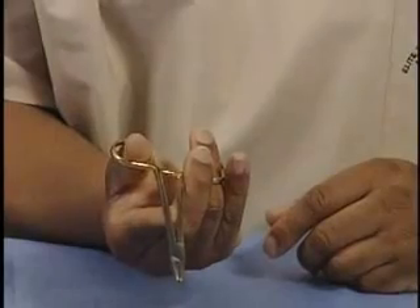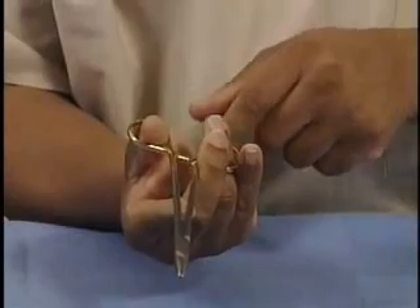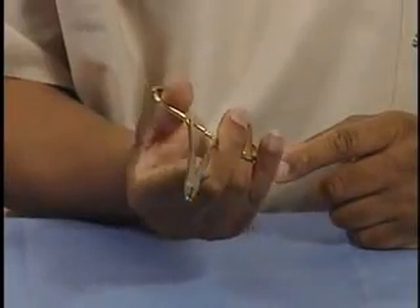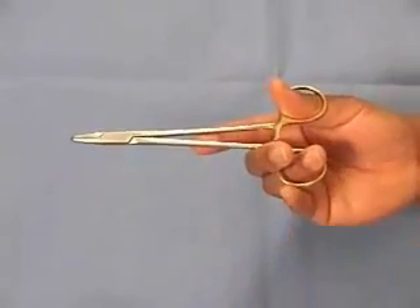To open the needle holder in this manner, you will push forward with the thumb and push towards the palm with the ring finger, the middle finger, and the pinky. Notice that we have multiple points of contact on this needle holder.